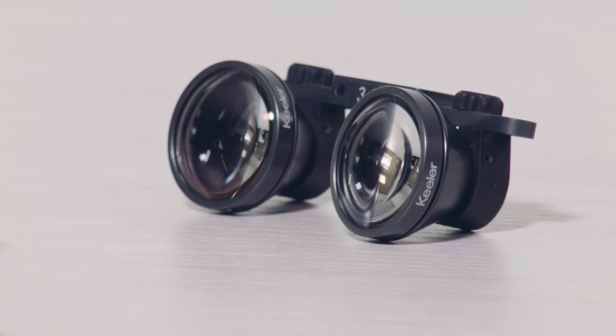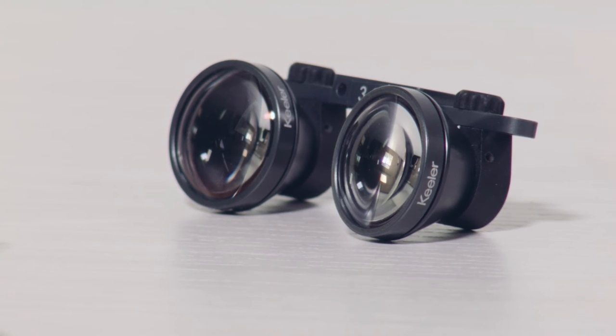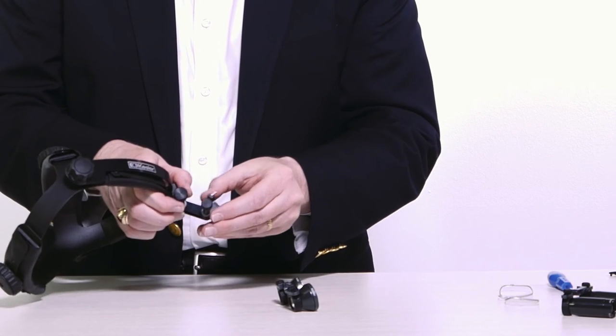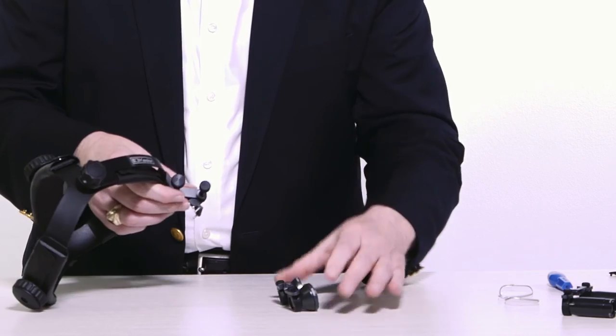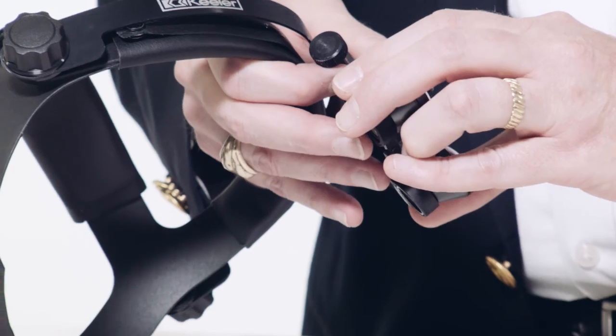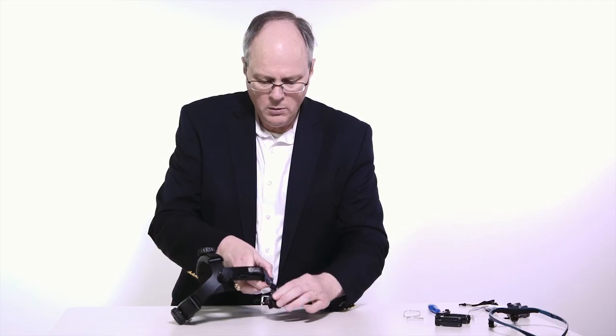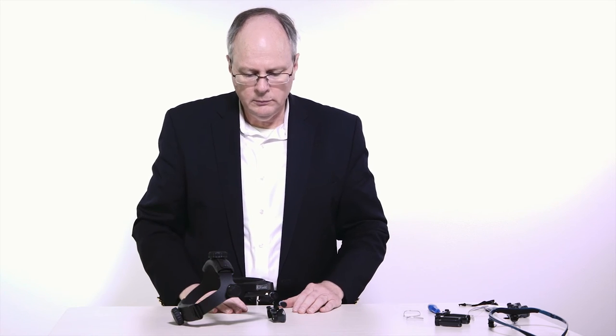The magnification and working distance of the loops is marked on the loop bar. Keeler loops are fit to the headband hinge by loosening the pivot mount knob and reversing the position mounting pins. Holding the loop PD bar, push them onto the pins as shown.